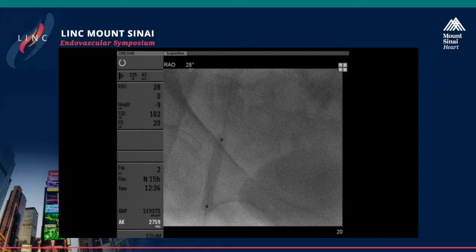So let me play devil's advocate a little bit, since we're all talking about surgery. We've treated quite a few of these femoral bifurcation lesions in elderly patients with substantial surgical comorbidities, and the results have been quite favorable. It's generally a double wire technique, a little less atherectomy, and if you have to use 2 filters, a little more drug-coated balloons in that particular case. And we've had very nice results. Again, like I showed in the iliac, you may not always get an optimal result, but you get a clinically relevant result, and these patients do quite well.